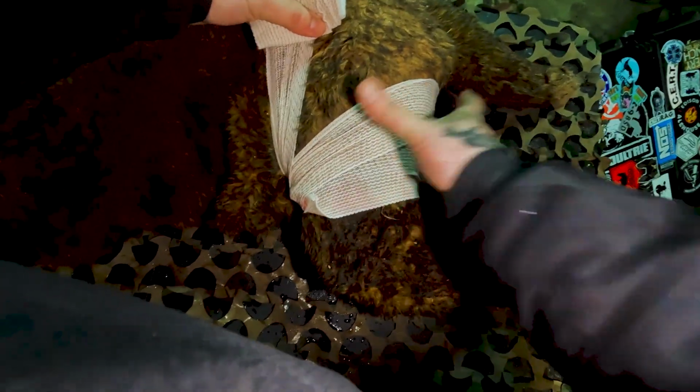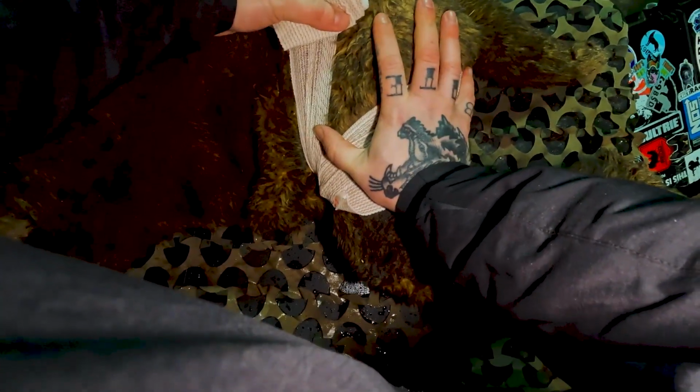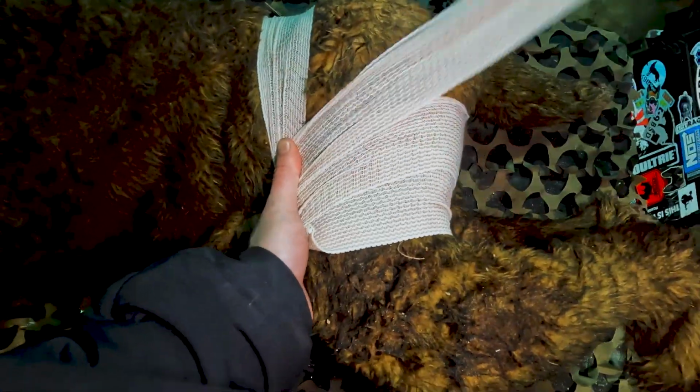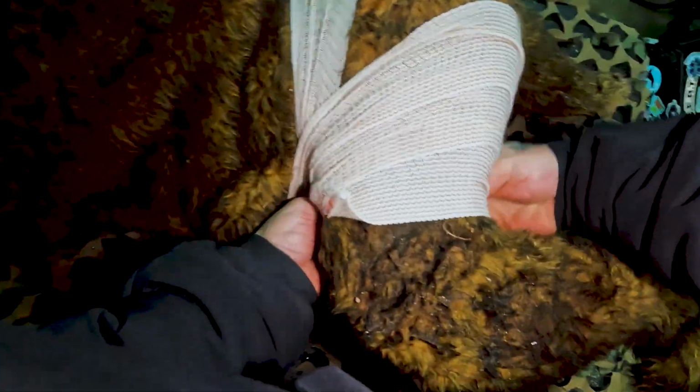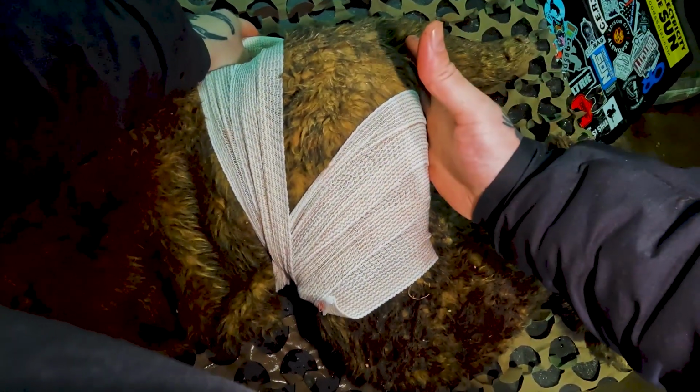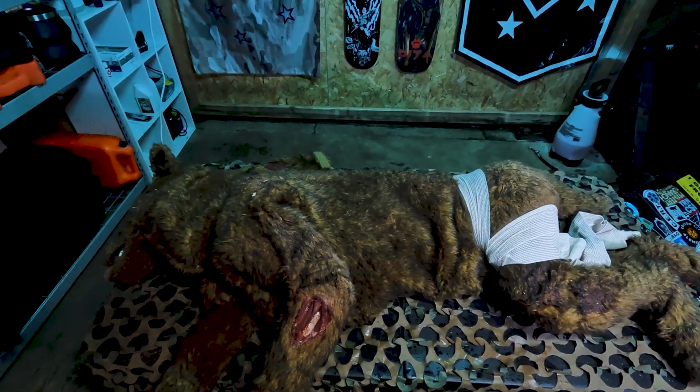So after a couple wraps over that, securing that in place, you can wrap over the back and underneath. And then try to wrap around again, then back up over. And it is tough because everything wants to slide down the leg. So that's pretty much it for canine extremity bandaging.